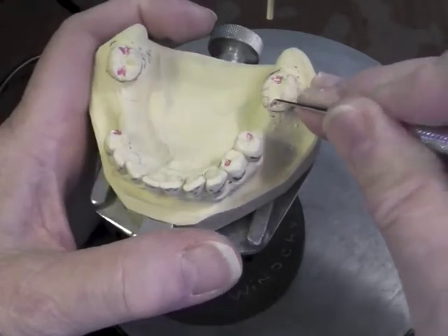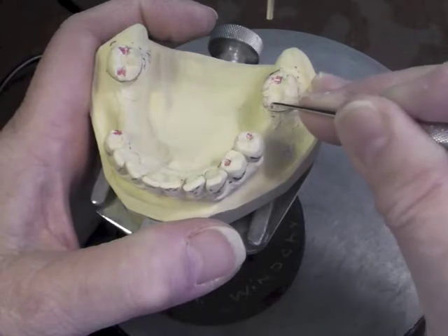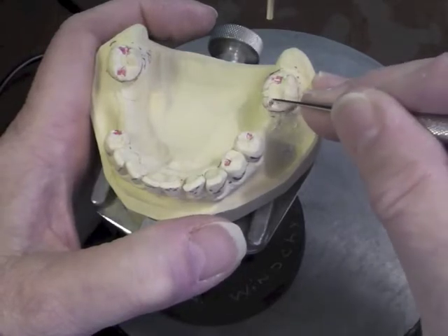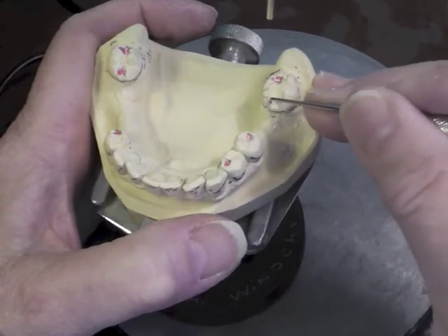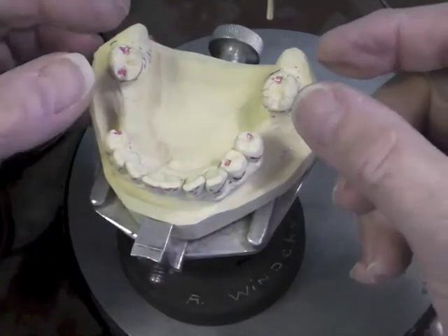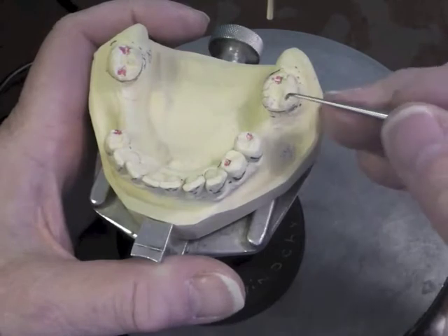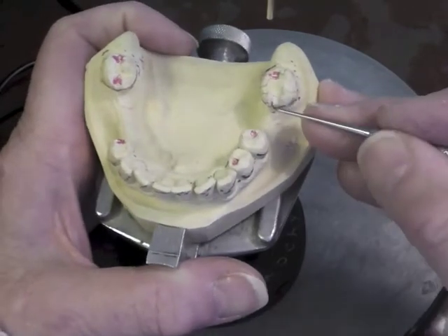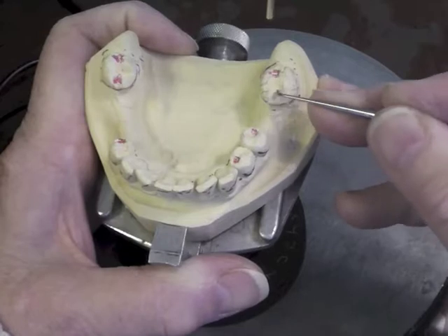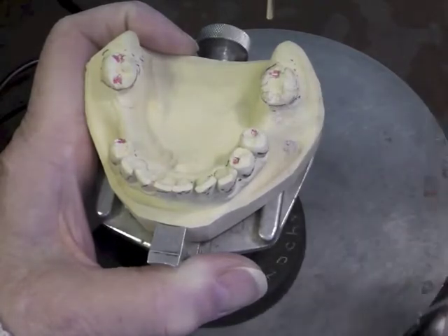With my cast still oriented in the same position, I'm going to take down a millimeter to a millimeter and a half on my marginal ridge. You don't usually have to take down the mesial too much on these molars that have tipped — you'll find they're actually out of occlusion with the opposing teeth, so I really don't have to lower that too much. If I did, I'd have to lower my guiding plate a little bit more.